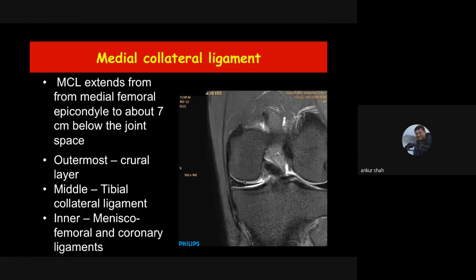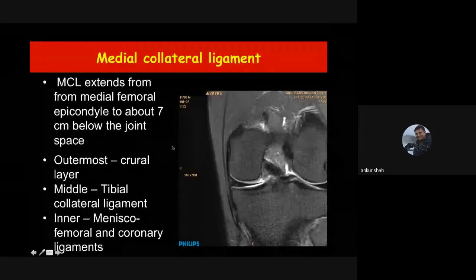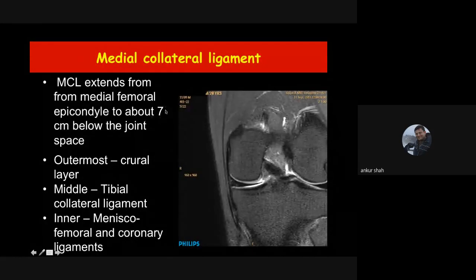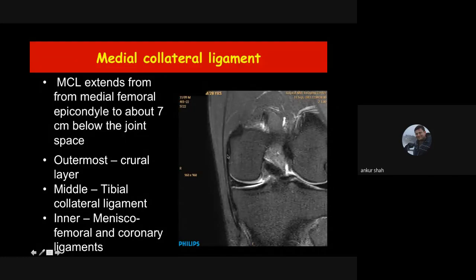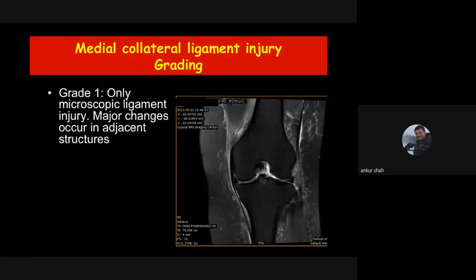The medial collateral ligament extends from the medial femoral condyle to the upper part of the tibia, with its attachment almost 7 centimeters below the joint line — so the field of view must be long enough to include the tibial attachment. It has three layers: the outer crural layer, the middle tibial collateral ligament, and the inner meniscofemoral and meniscotibial components. Together these form the medial collateral ligament complex.